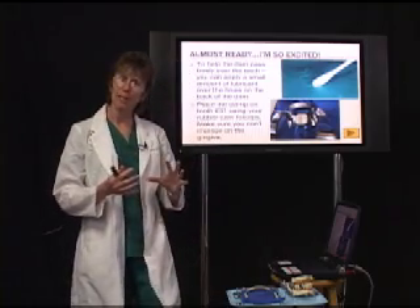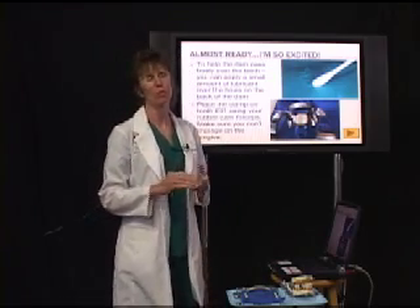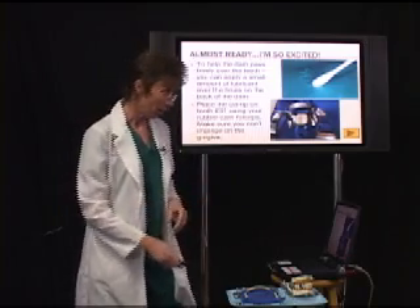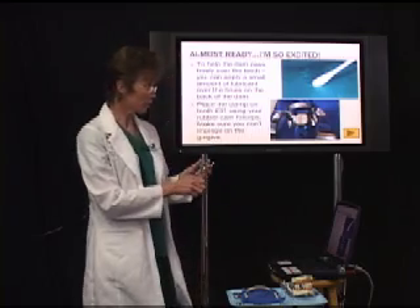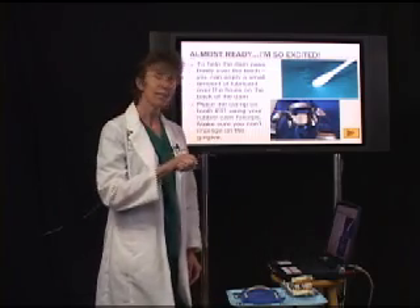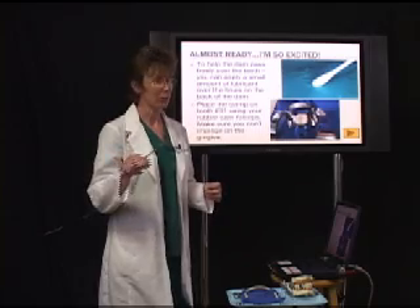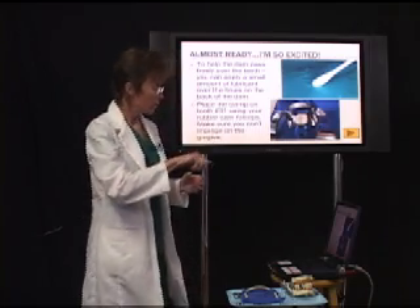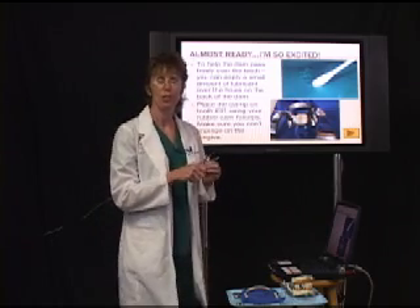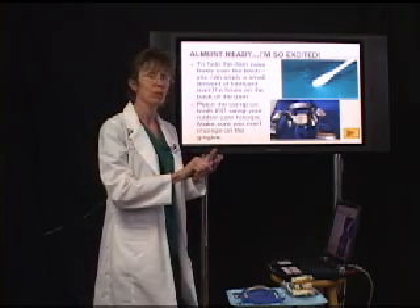The next step: you've got your clamp in place and it's ligated. On the back side, you have the option of placing some lubricant across those holes to make the dam pass more freely over the teeth. Then you're going to place the clamp on the tooth using your rubber dam forceps — two little prongs fit into the holes on the clamp on both sides. We're clamping 31 and working on 30. Usually start on the lingual side, making sure you don't impinge the gingiva. Slide it right next to the gingiva, then slowly slide it over to the facial side and release.